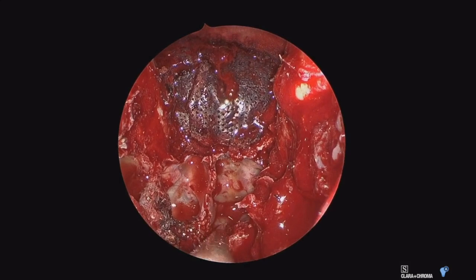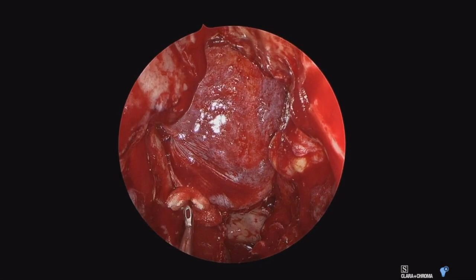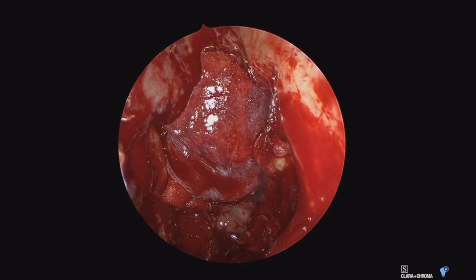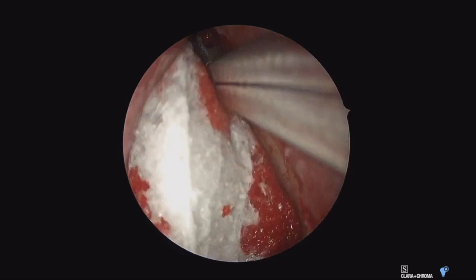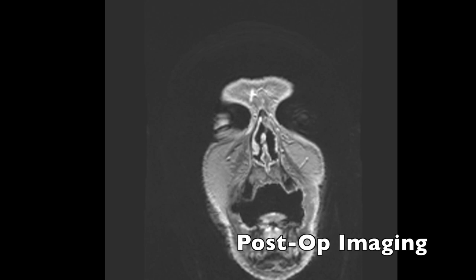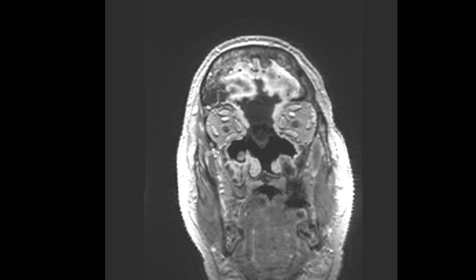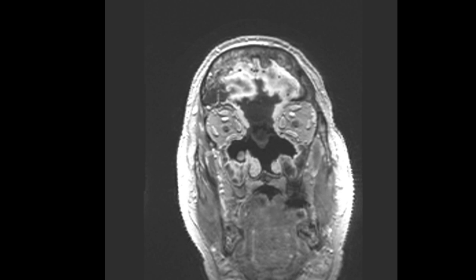For our typical reconstruction in cases such as this, we use fascia lata as a primary closure patch in the dura, sutured to the dural defect. We then lay in our pericranial flap covering the entirety of the cranial base from planum to the remnant inner table of the frontal sinus, orbit to orbit, and reinforce some of those edges with additional fascia lata as needed. After we are satisfied with the reconstruction, I typically put some absorbable packing material in the nose. In cases like this where there is very little support in the nose and the majority of intranasal contents have been resected, I will typically place some Merocel sponges as well — in this case, four gloved Merocel sponges underneath our packing. Here is the patient's postoperative MRI scan showing an extensive resection, cranialization of the frontal sinus, and reconstruction with a pericranial flap and fascia lata graft with the neo-dura laid up there.